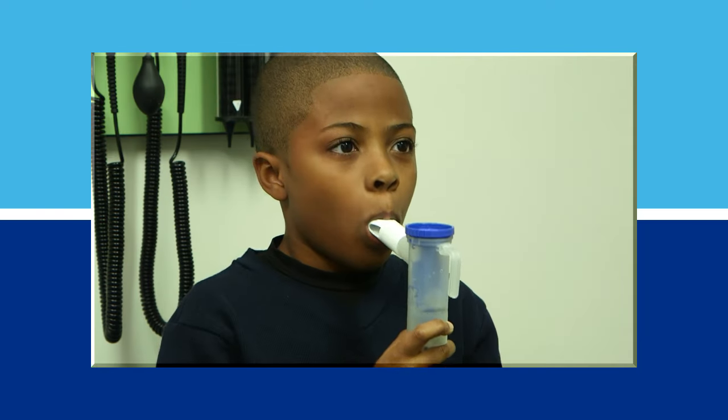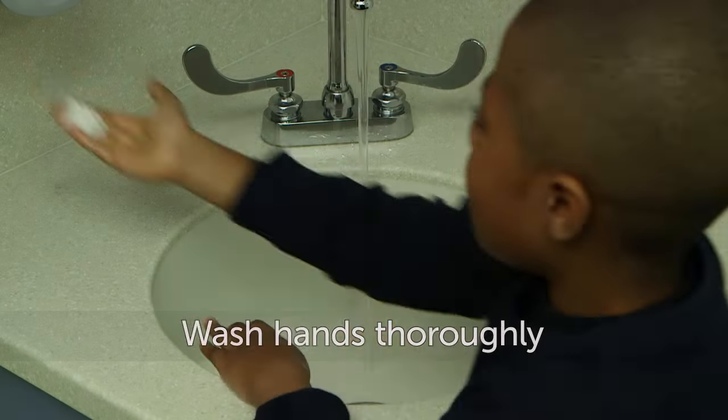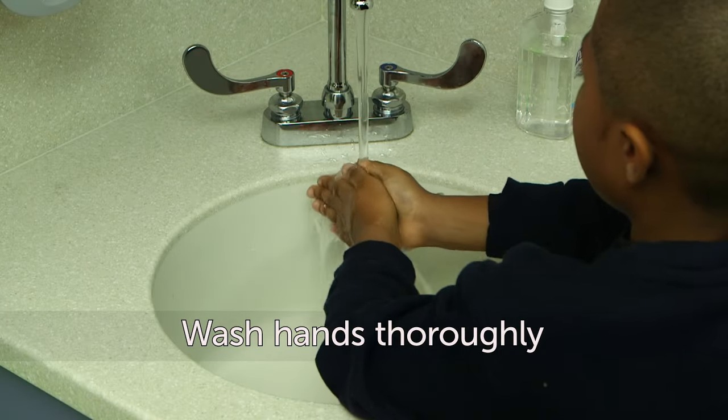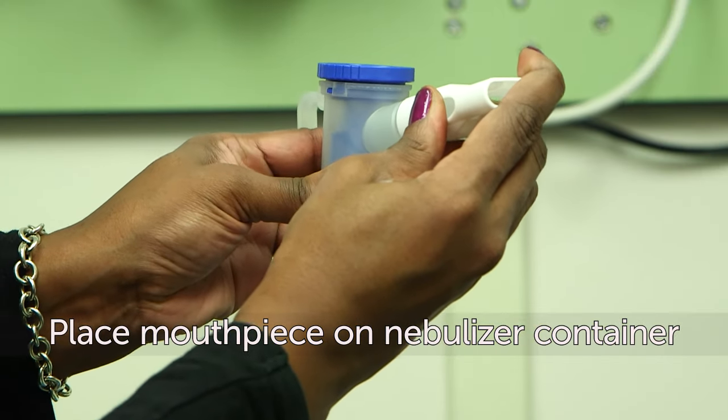For the best results using a nebulizer with a mouthpiece, follow these steps. First, wash your hands thoroughly. Next, place the mouthpiece on the nebulizer container.